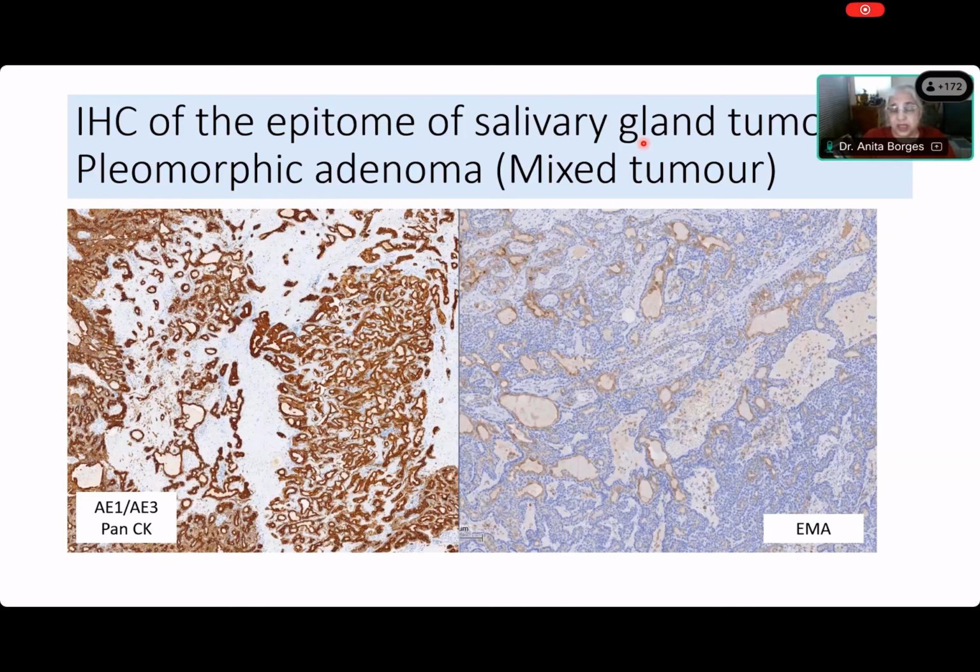You have myxohyaline cylinders and stroma, sharp outlines to the nests. You can see that. In a pleomorphic adenoma, the myoepithelial cells showed you one of their patterns, that is diffusing out into the myxochondroid stroma. In an adenoid cystic carcinoma, this does not happen. You have a sharp outline to the nests. You have true tubules, which Akshara rightly identified, with secretions present, in this case few, an overall basaloid appearance, uniform cells, and inconspicuous mitoses. So now, come on, Somik, is this a salivary gland neoplasm?